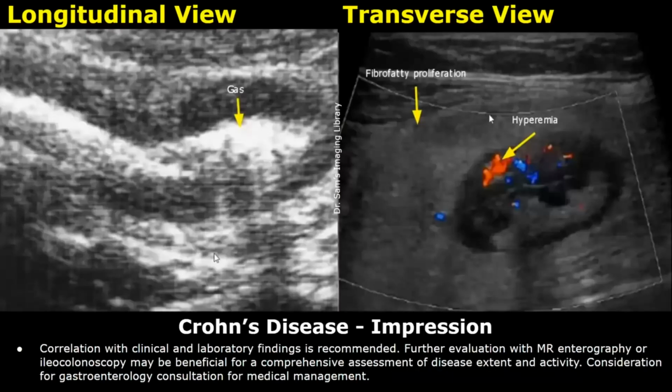Correlation with clinical and laboratory findings is recommended. Further evaluation with MR enterography or ileocolonoscopy may be beneficial for a comprehensive assessment of disease extent and activity. Consideration for gastroenterology consultation for medical management.